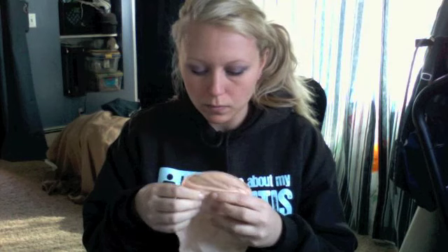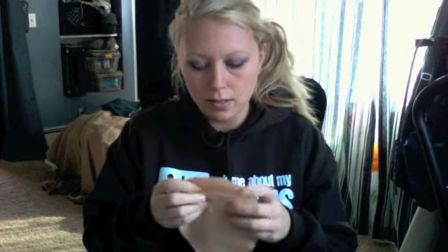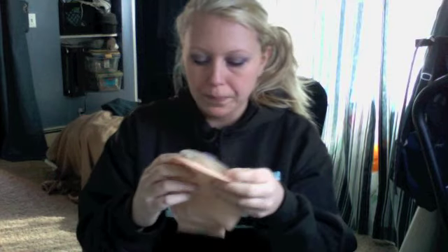So the thing about the click is it swivels. When you put it on, you snap it into place and you lock it. This piece right here is a lock. You just close it and then it's locked, and then it can't turn. When you want to unlock it, you press it here, it snaps open, and then you can move it. You can't really see this very well, so I'm going to stick it on me so you can see it. But this is the basis of how my thing was so awesome. So let's stick this sucker on and see how this goes.